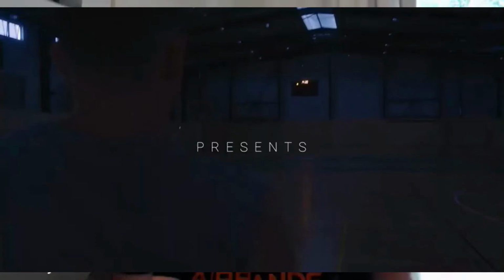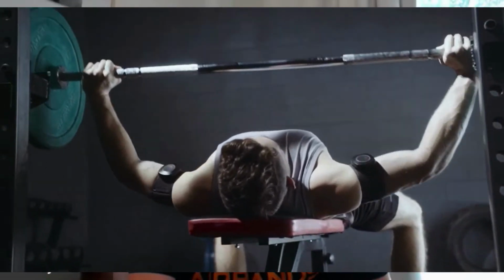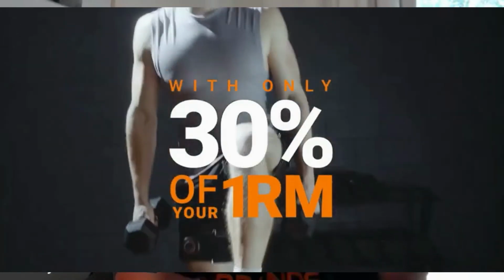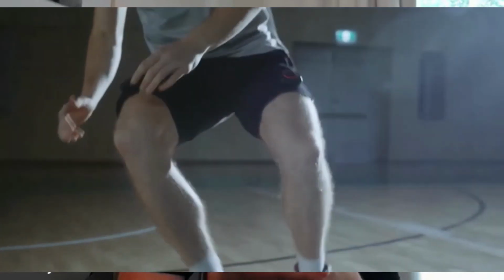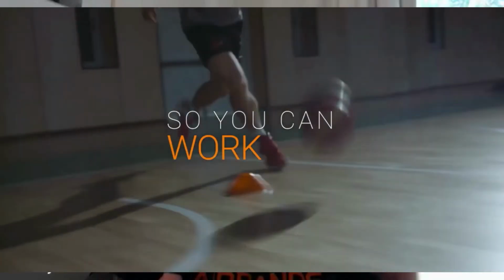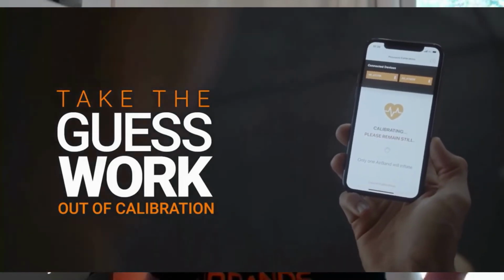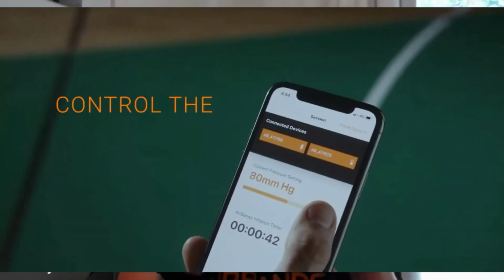But in summary, basically what it's doing is it's allowing for occlusion of your arterial pressure around the arteries of a given limb. So that's either going to be at the proximal site of your proximal femur or towards your proximal humerus. Generally speaking, you're not going to do any occlusion below the most proximal portion of that extremity. And then it's going to calculate how much resting or occlusion is needed from a resting state or throughout an entire exercise program, depending on which system you're using, to determine how much blood flow is going to return to the system versus stay in that given extremity.